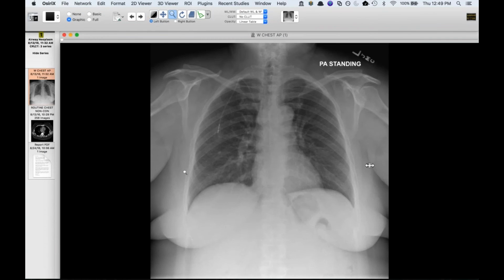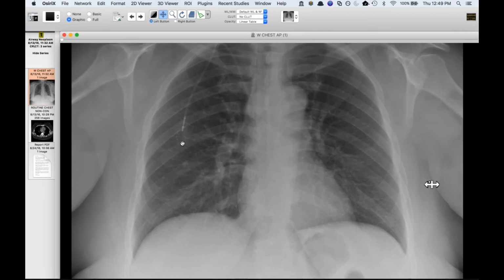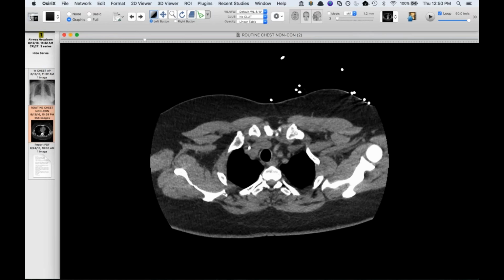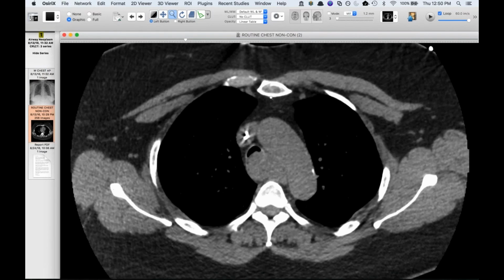All right, now I'm gonna get serious here. I was working a couple weekends ago or last weekend, and this one came in, and I'll let you look at the radiograph for a second. This is along the airway theme, which is a big clue that Jeff and Howard have already shown. And clue number one, she's got a port, so something's going on with her. But her history is now 2 months of worsening shortness of breath and more recent stridor and wheezing. And you can see it looks like there may be something in the distal trachea, because you should see a carina here, and it looks like you get this inferior bulge here. And the port obviously will come into play with this too.